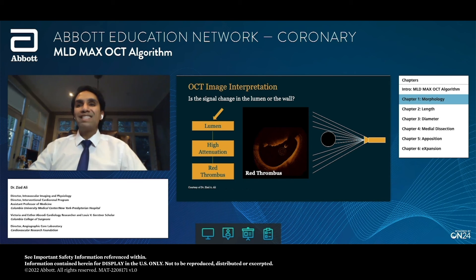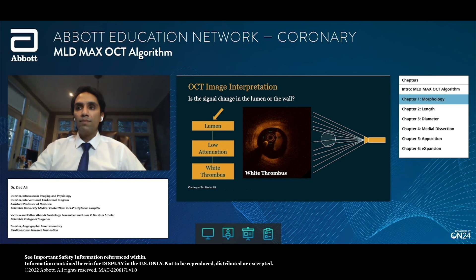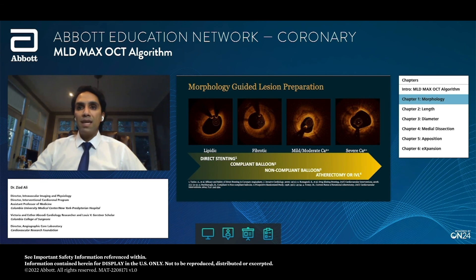If we hold those same principles for the lumen: when there's high attenuation in the lumen, all of the light is being blocked — that's red thrombus, near-infrared light hitting a red object being completely absorbed. When you have low attenuation — when the light hits an object but is able to see behind it — this is white thrombus. Simply put, those are most of the things you need to know to start image interpretation for OCT-guided PCI.